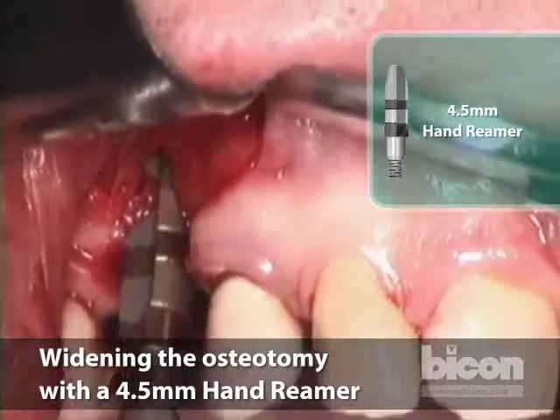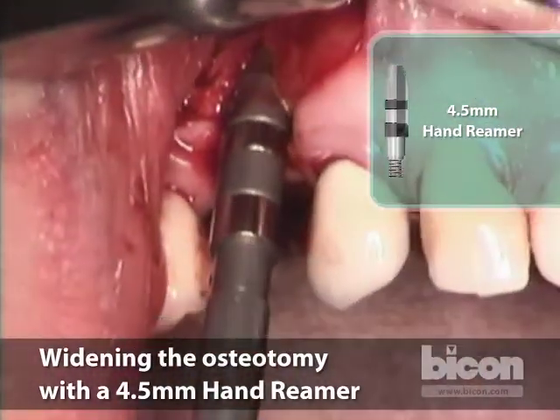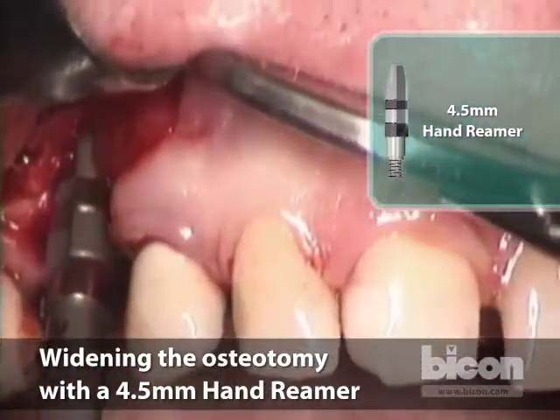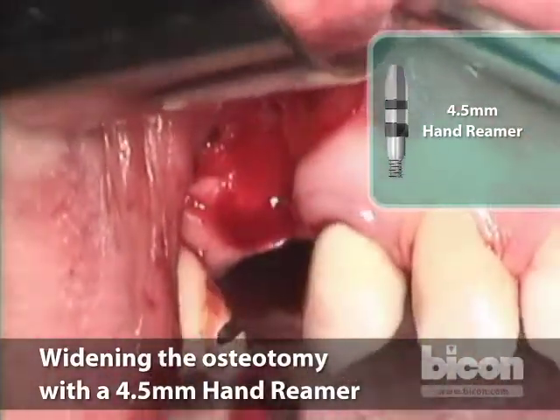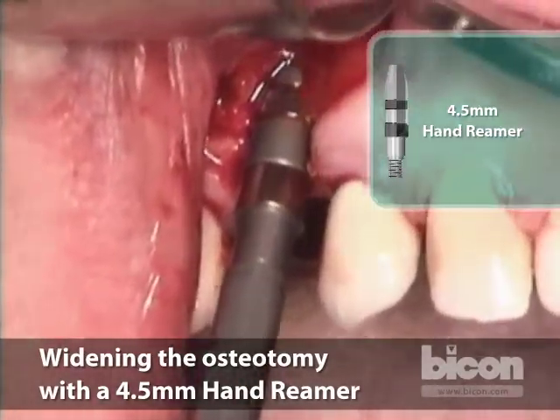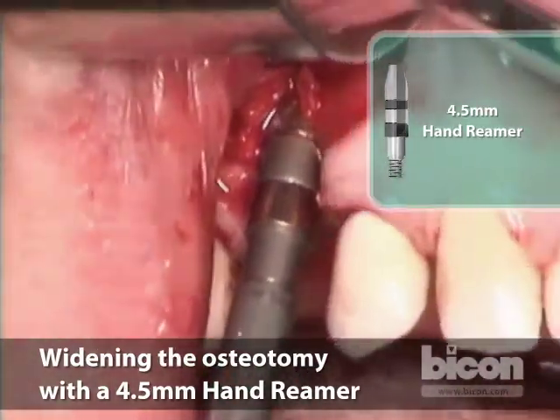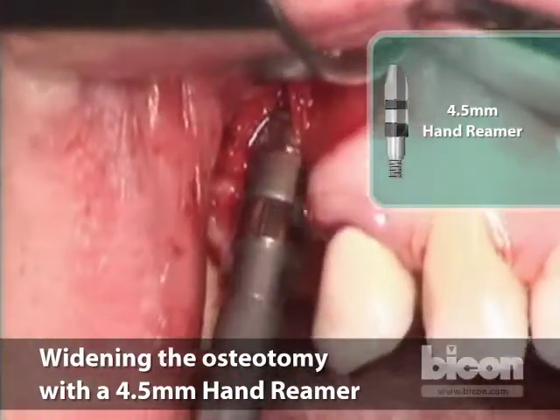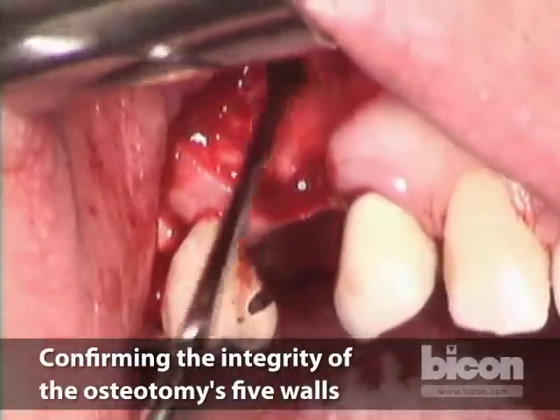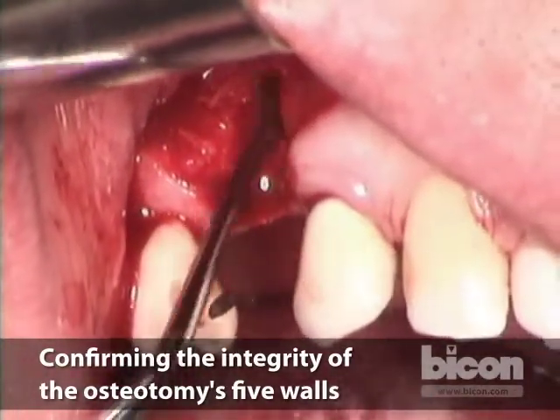Okay, so what we're doing now is selectively carving out from the palatal side while somewhat expanding the buccal aspect, okay? And so we are now at about 6 millimeter depth. We need to go another 2 or 3. Okay, so now that we've reached the basal part, I can go full circle, and that will allow me to get to the full depth as I want it. Now, the periosteum in the area is largely intact with the exception of that little band.